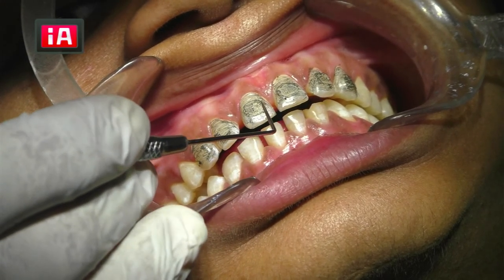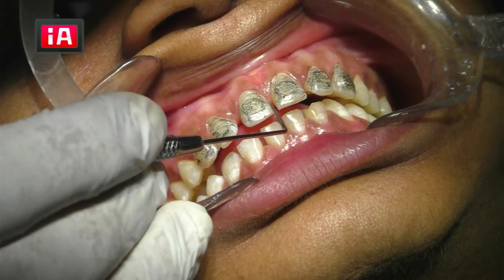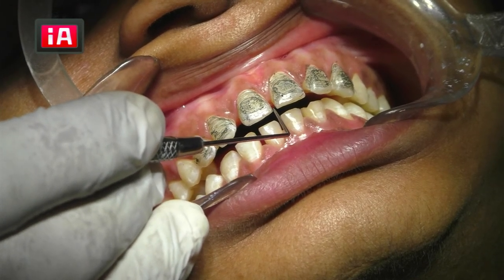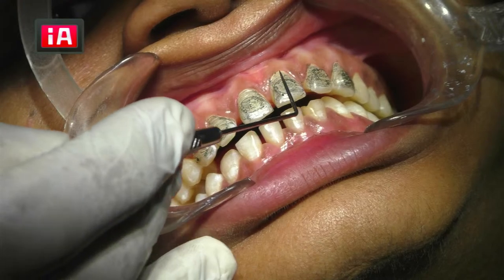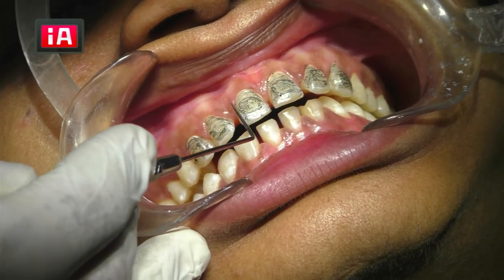Otherwise, if it is only a veneer, there is no space. Your preparation ends at the contact point. It should not cross or break the contact point. Here there is no contact point, so we are creating the contact point, and it has to cross the proximal side.